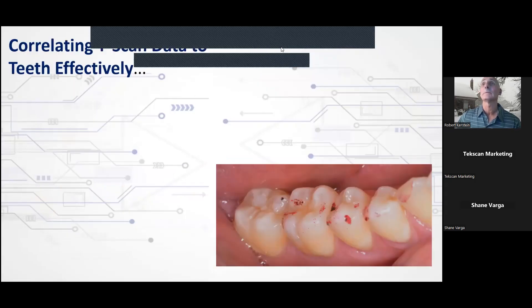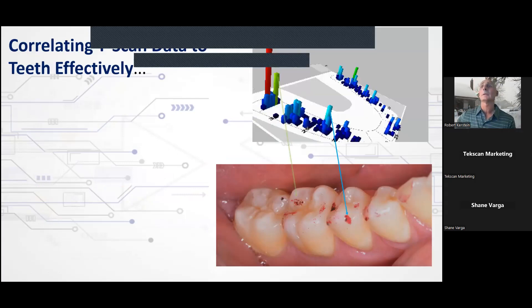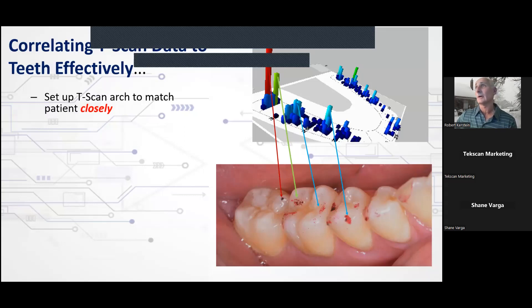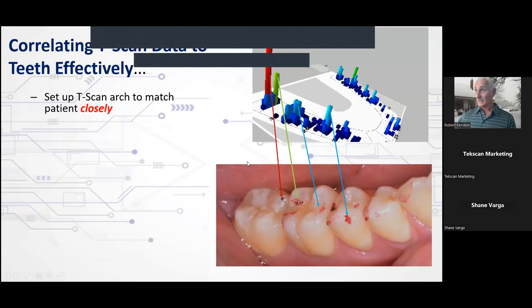Correlating TSCAN data is actually the challenge, and to do it effectively you have to do a number of different things. Most importantly, the first step is you must set up the TSCAN arch to match the patient closely. Many of you may enter the central incisor width and take out third molars, but that isn't matching the arch accurately — that's just getting you started. Manipulating the data and changing the arch to fit is a skill that helps correlate predictably.